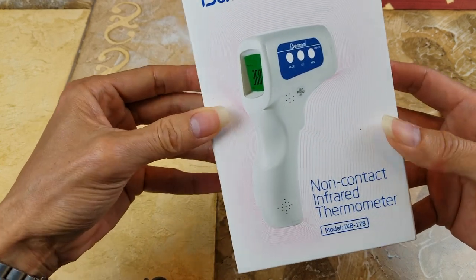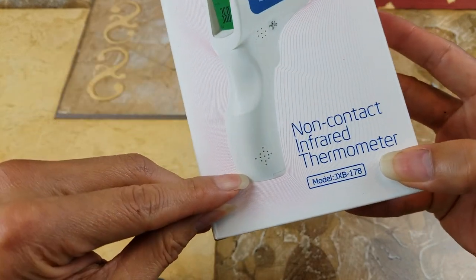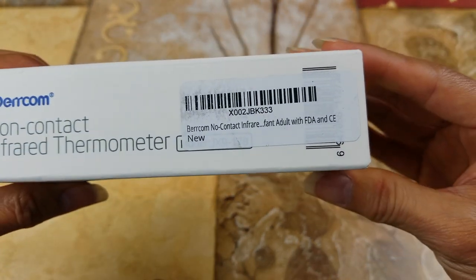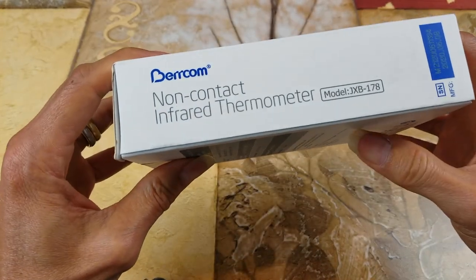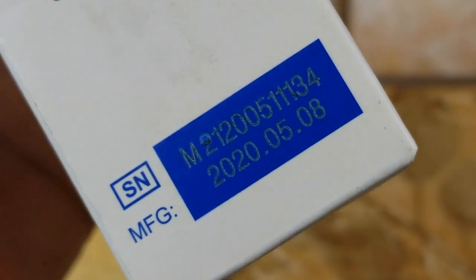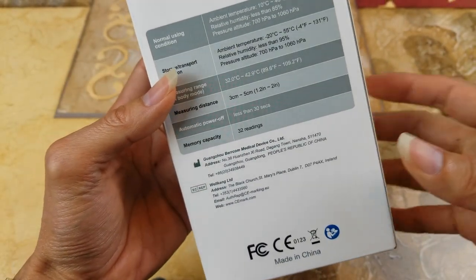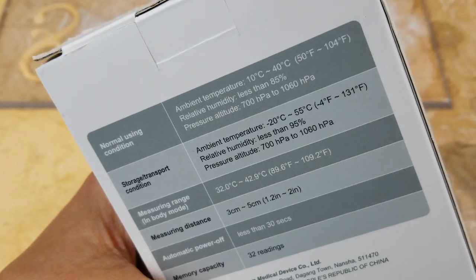Berrcom. I believe they are like a speaker or something — that's why they have a hole. And here's the barcode. This one is made in China.